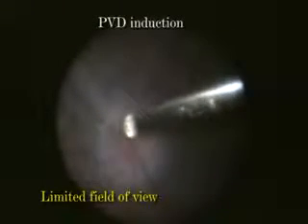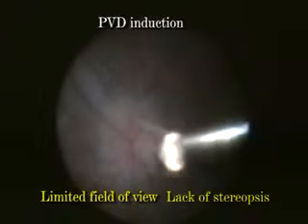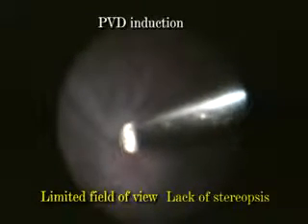PVD induction can be challenging because of the limited field of view and lack of stereopsis. Advanced PVR changes with anterior contractures pose great difficulties even in conventional microscopic vitrectomy. The endoscope grants surgeons an in vivo perspective of structures rather than the contorted view via scleral depression.